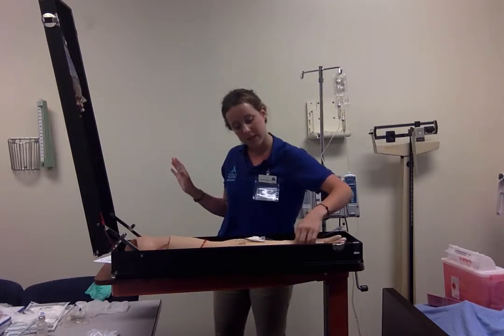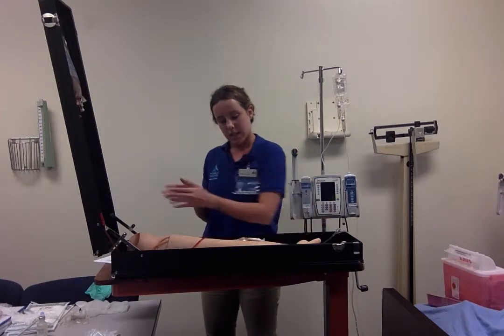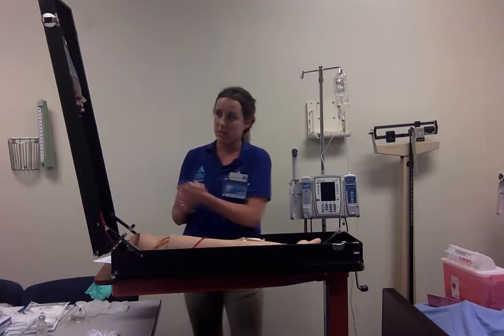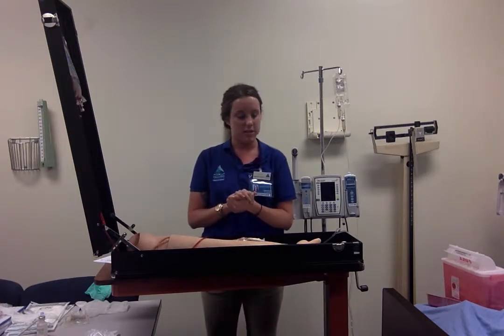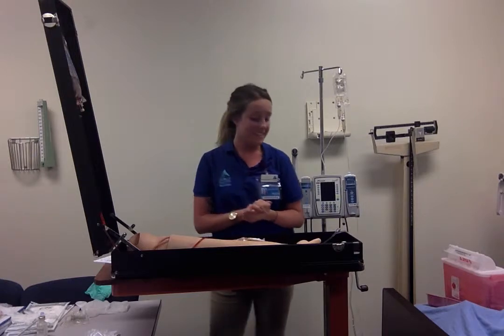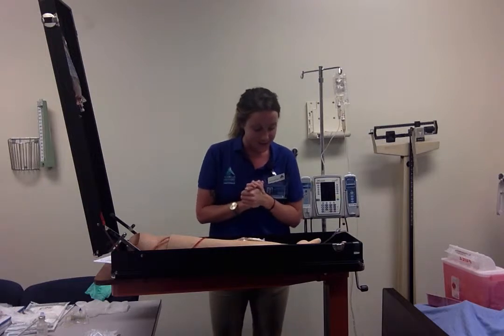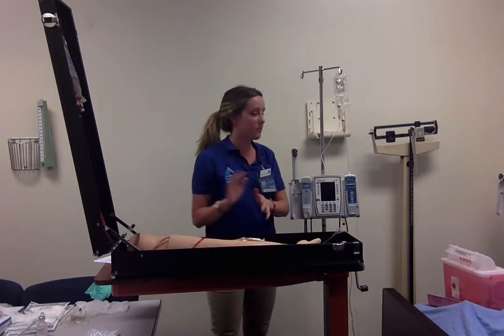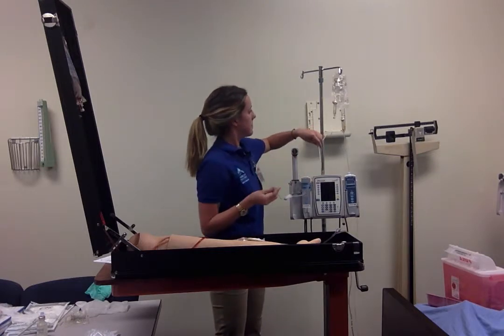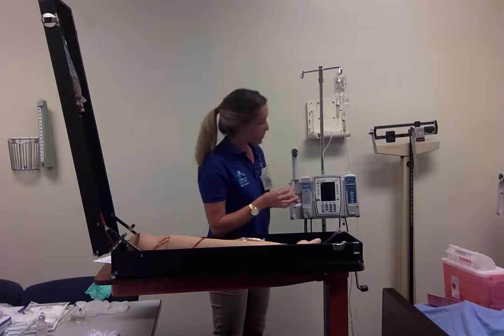I'm going to identify the name and date of birth. The patient has no allergies. And how are you feeling today, Mr. Smith? Good. I'm Lexi. I'm going to be administering a piggyback to your already existing IV. And so now I'm not going to put clean gloves on yet, and I'm going to really quickly make sure this is all primed.